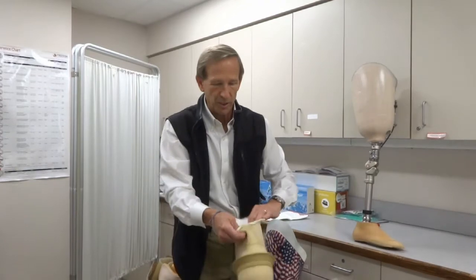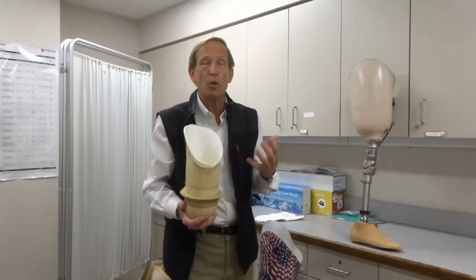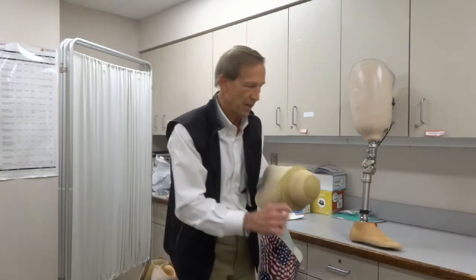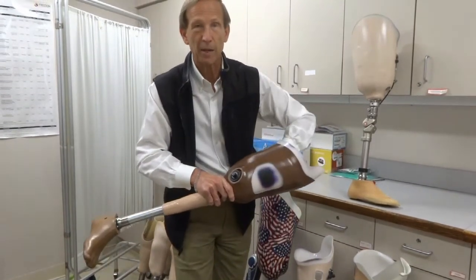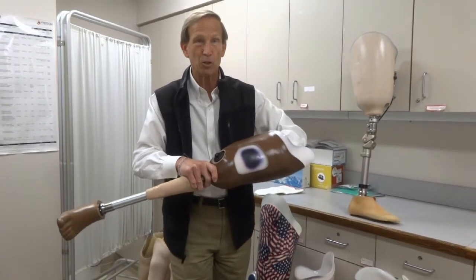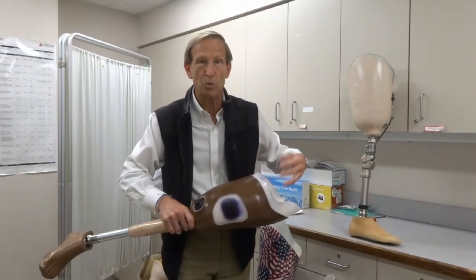The gel liner goes on inside out — you invert the gel, put your leg in, and roll it on, and that gel becomes the interface. It can also become the suspension, the process of holding you attached to the prosthesis. This particular gel liner has a rubber ring or seal — it's called a seal-in liner. When it goes inside the socket, it creates an air seal. As it goes down, air blows out through a one-way valve, and once you reach the bottom, air does not come back in, creating essentially a vacuum. This can be a passive vacuum with just a seal and one-way valve, or there can be an electronic pump with a tube that sucks air out and creates elevated negative pressure, holding you in nice and tight.